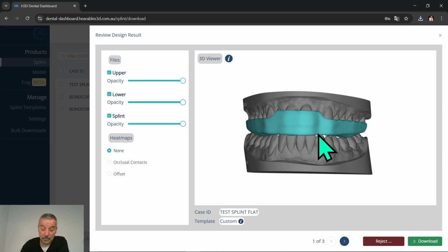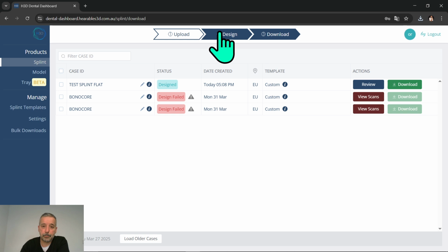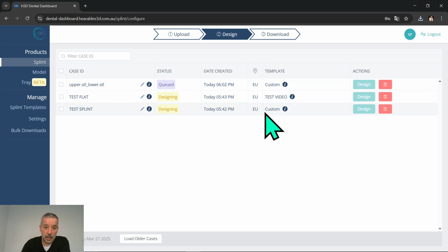That is crazy, because you have a chance to put a lot of cases, like you see before, 100 cases to upload together, and the machine learning works for 100 cases at the same time as for 10 cases or 2 cases. I need a little more time, but not a lot, and not just a human. 100 cases for a human is a lot. It needs a lot of time, obviously, and that is one of the benefits of artificial intelligence.